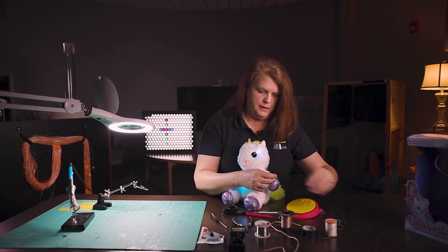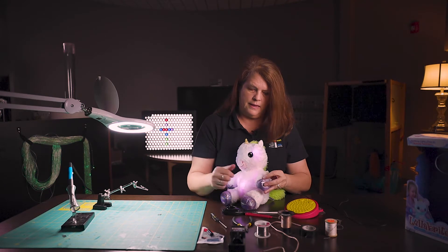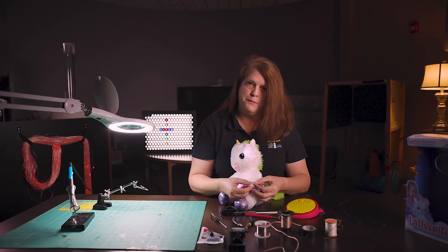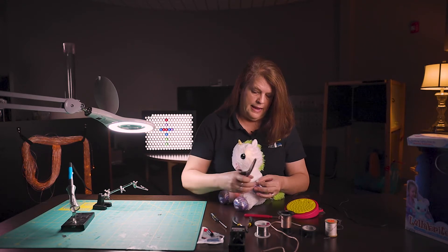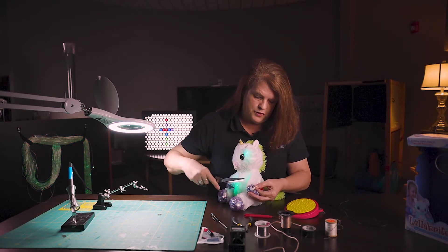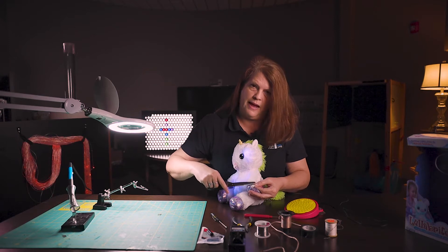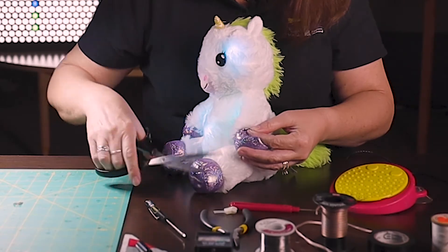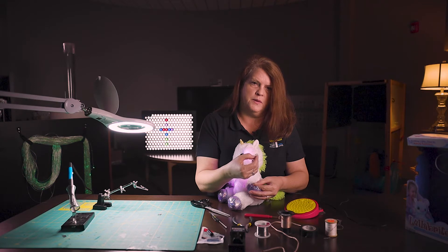After you pull out the threads, you're going to pull out that switch and you'll see two speaker wires. That's where we want to start with cutting. My advice is to leave a little bit of extra wire here just in case you ever needed to solder this switch back for some reason. So I'm going to go ahead and cut. Now that toy is no longer activated with the small switch.